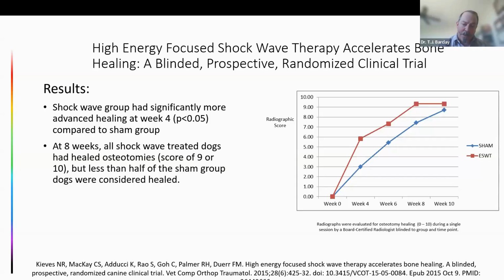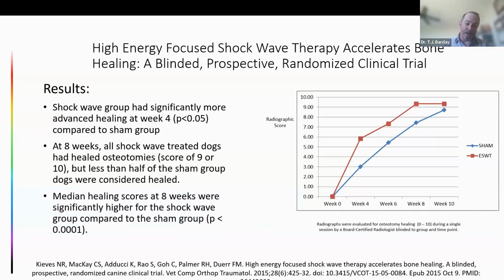And this was data from that initial part of the study where they evaluated them at 4, 6, 8, and 10 weeks after surgery. Moving on into the second phase of that study, where more dogs were enrolled, they were only evaluated at the 8 week time point, but they did achieve statistically significant healing to a very high degree at that 8 week time point.